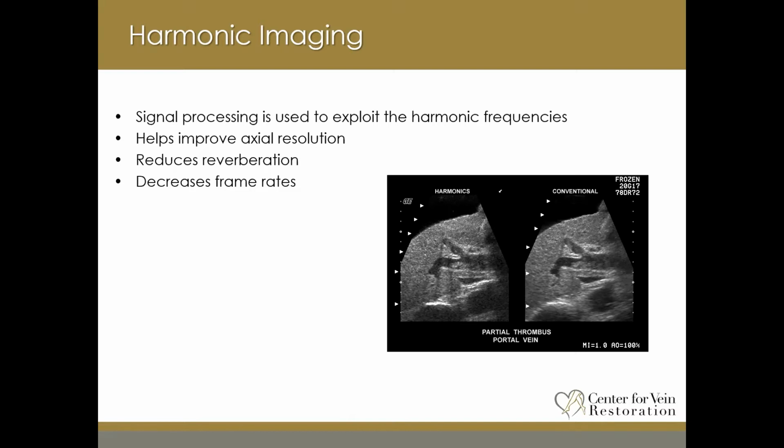However, sometimes turning off the harmonics brings out additional information. In vascular, it's preferred to see images more contrasty, where they have less shades of gray. We like to see edges rather than subtle changes in the tissue. So turning off the harmonics may improve the contrast.